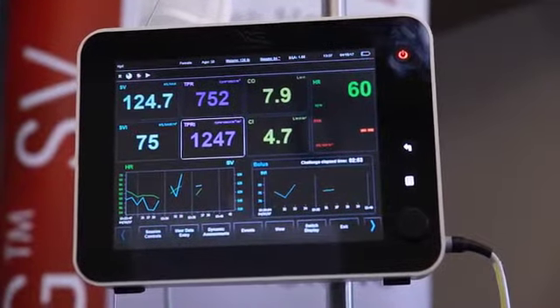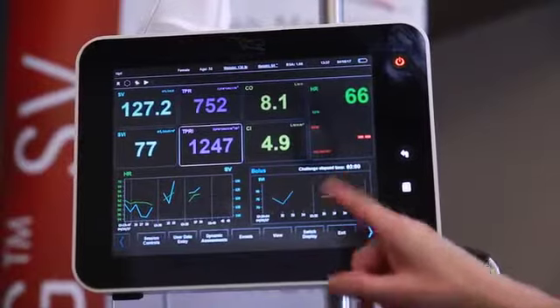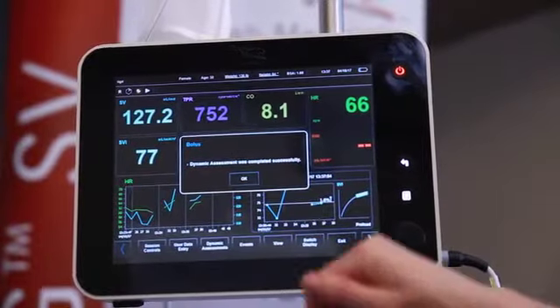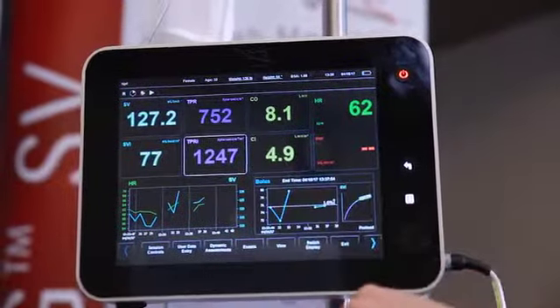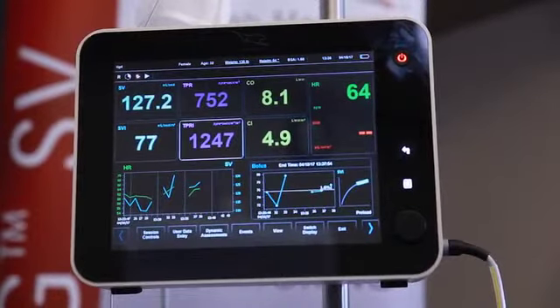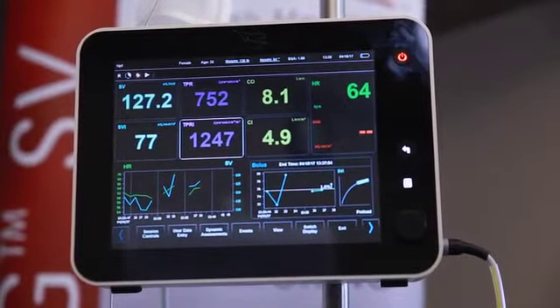All right, you guys, so once the bolus is complete, again, we waited for 1 more minute to allow that fluid to circulate. So now we're at minute 3. We're going to select dynamic assessments, and we're going to end the bolus on the monitor. Dynamic assessment was completed successfully, and we're going to click OK. So just remember, again, waiting 1 minute after the bolus injection before ending the protocol ensures the peak stroke volume is captured in the equation for fluid responsiveness.